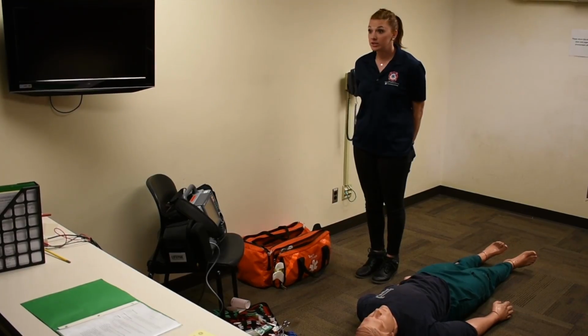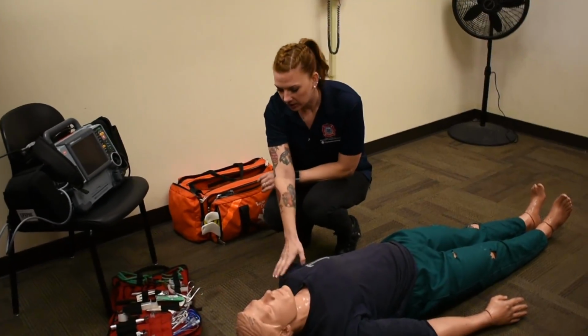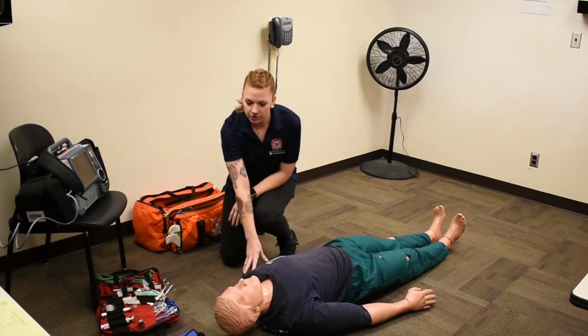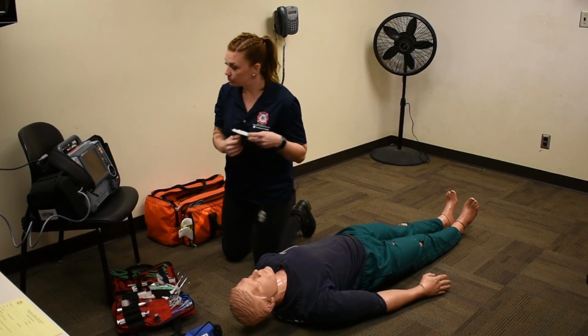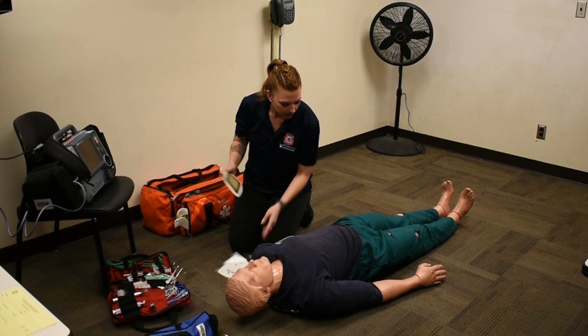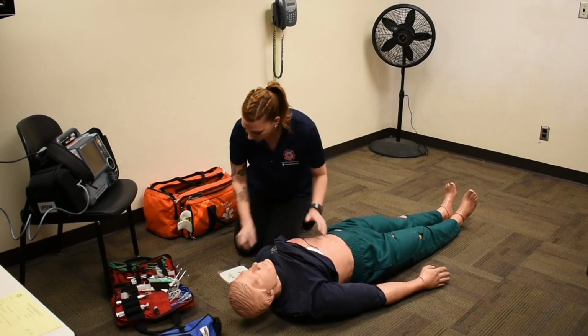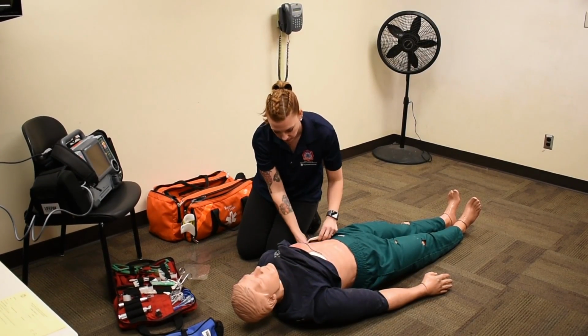You may begin. First things first, BSI, scene safe. Sir, are you okay? And he responds to me? Yes. Okay. First thing I want to do is go ahead and get him on the monitor. I will probably pace pads at this time because you told me that he was quite bradycardic. I'm going to let him know that I'm going to be placing some pads on his chest. I will also put a 5-lead on too, just so we can get a good look at what's going on.